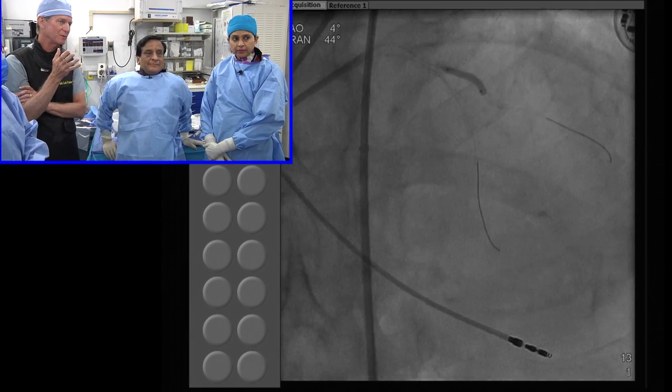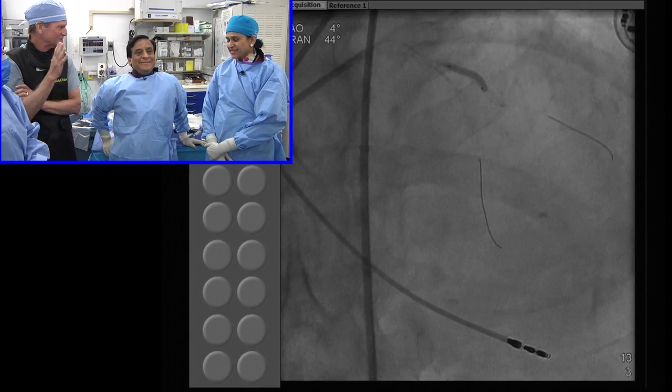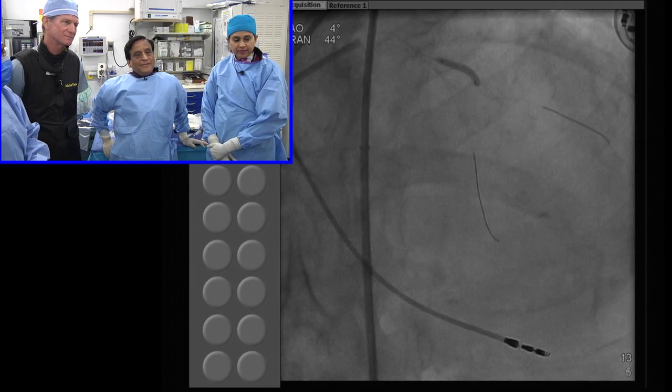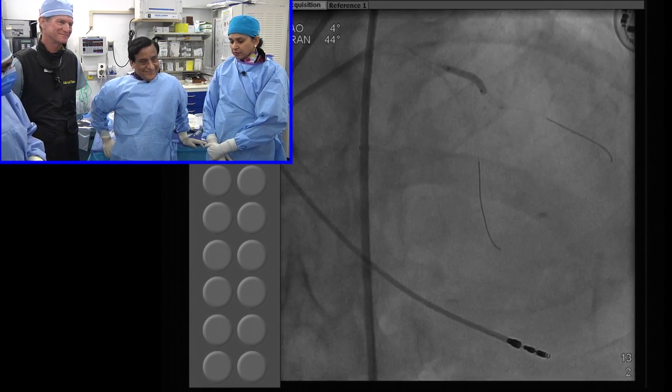And then as you saw with the post-dilatation, there was a big step up in the final lumen. Even without OCT, you knew that. Yeah. But I think it's fantastic to see the OCT. So congratulations on a great case. And Samir, this could be the first case in the United States of rotational atherectomy followed by Absorb. Absolutely. I think so. And I think numerous more.